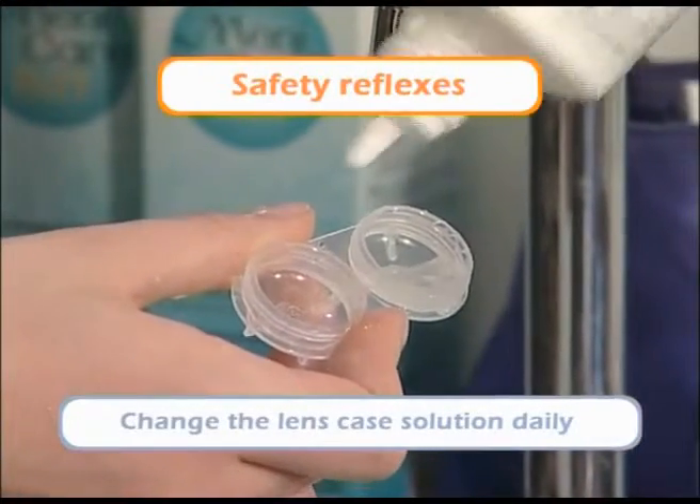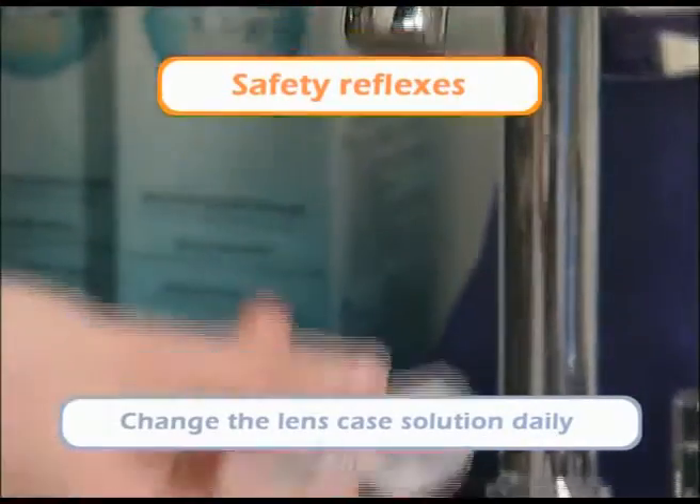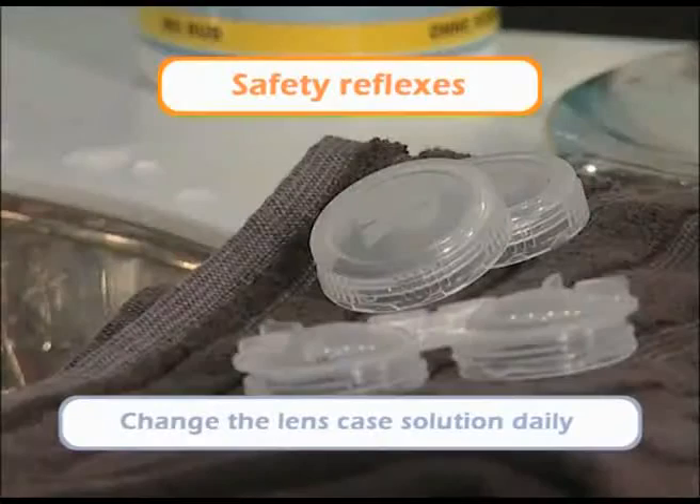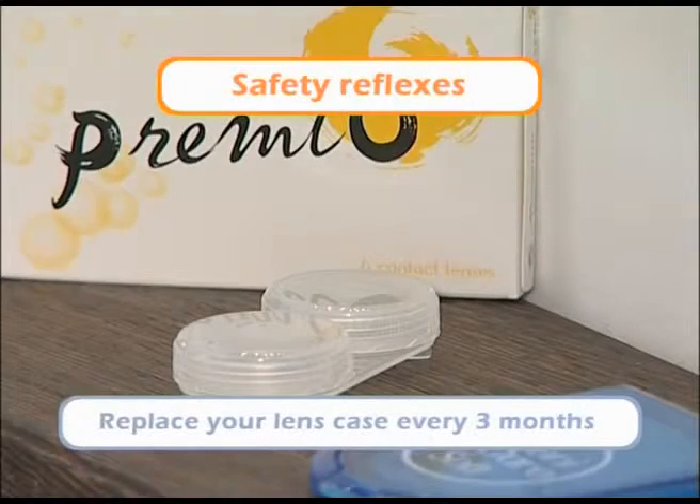Change the lens case solution daily. Empty the holder after putting in your lenses, then rinse it with solution and let it air dry. Always keep your holder very clean and replace it at least every three months.